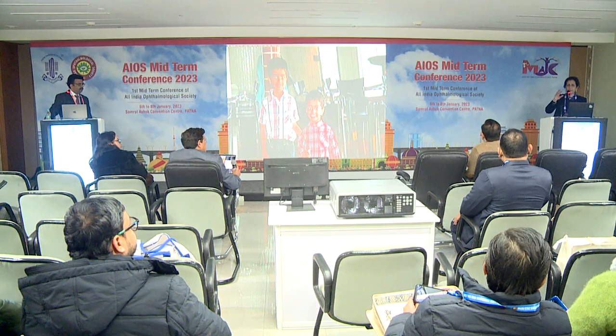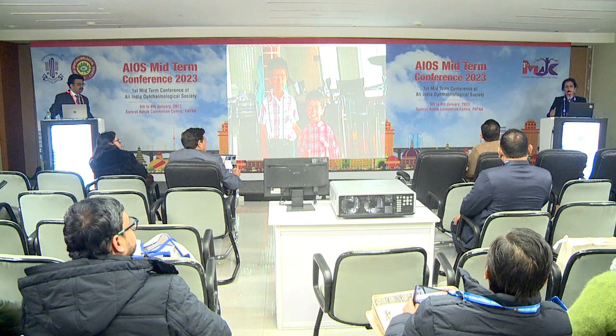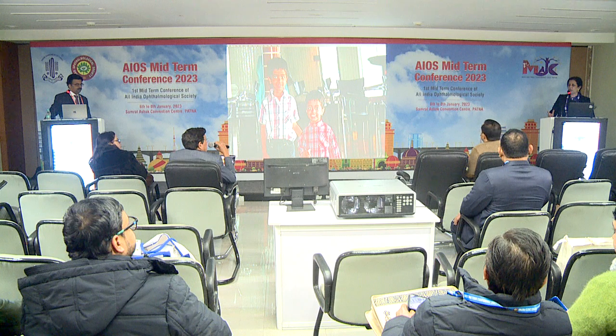But having said that, you measure your total K and you can go on to place it into the Barrett formula, Universal 2 or Toric or TK, and then you would get the best of results. I'm sure you would have a lot more to add.